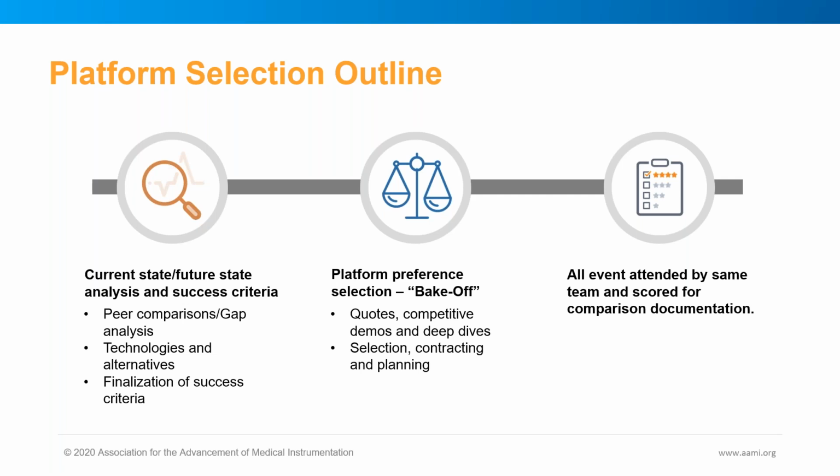Using that methodology, Parkland's selection team performed a step-by-step analysis of their own organization. Starting any of these types of projects, you want to start with a current state compared to a future state. And many times current state is nothing and future state is we want full visibility into medical devices. And once you know what you want your future state to be, then you can look at a few of the vendors in the arena.